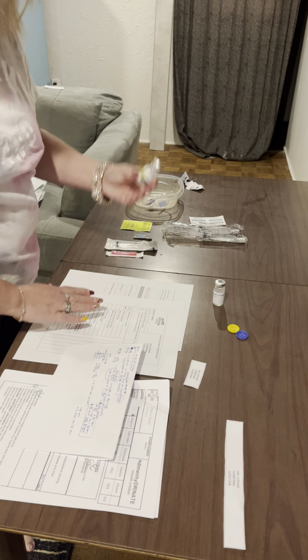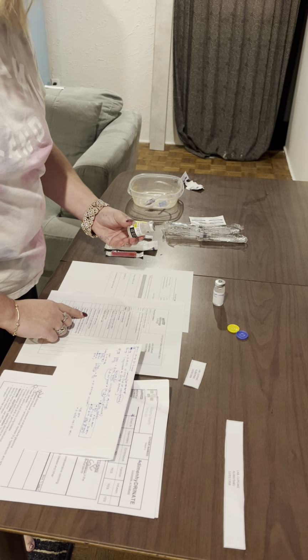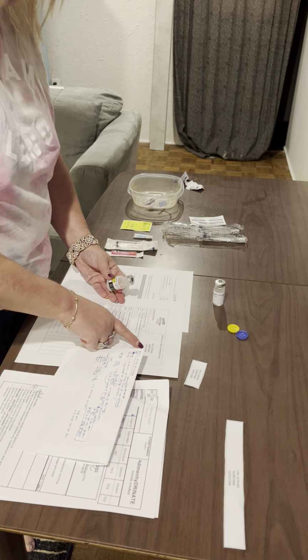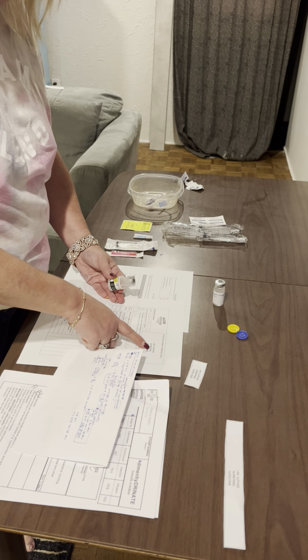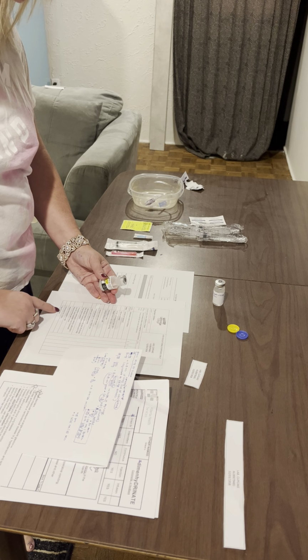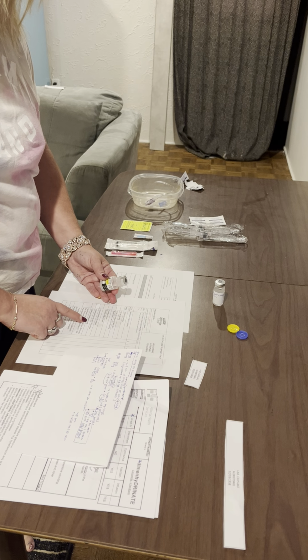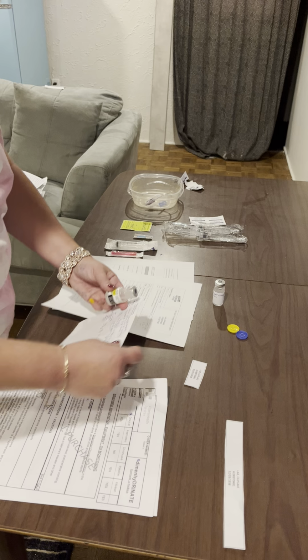And again, just because I like to double check, we will double check this with our order. So Cupcake Labs, December 12th, 1958, 79481. We'll check with our physician's orders, and it says saline lock between meds. So we will check that with our med math.